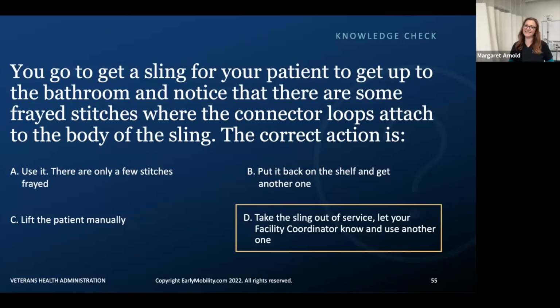The correct answer is D. Any of the other ones are going to be unsafe for your patient and put your patient at risk. Lifting the patient manually is not a solution because it puts both the caregiver and the patient at risk as well.